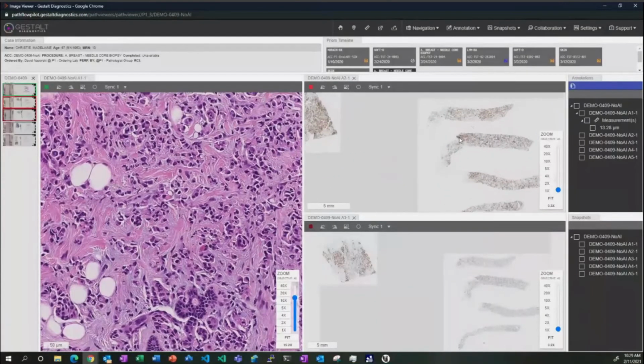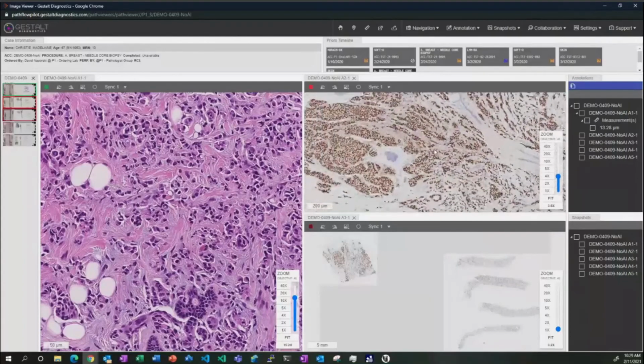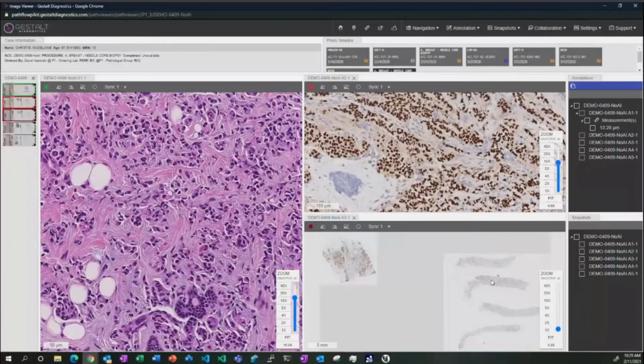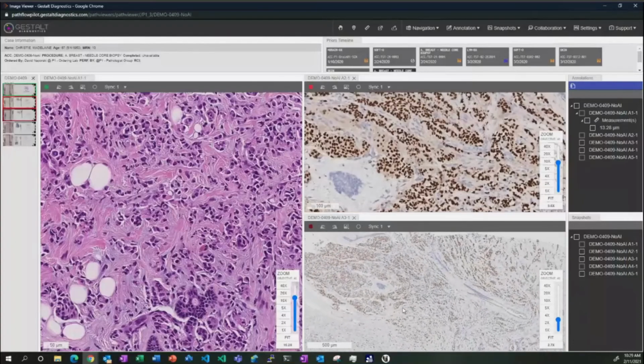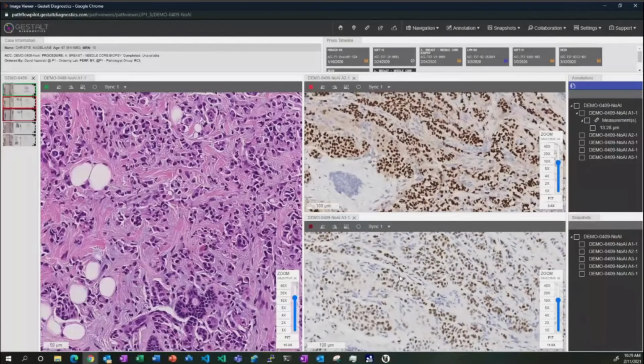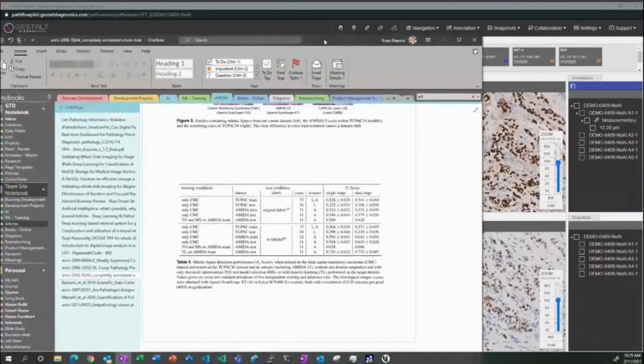So I think that probably at a certain point, like a multitask pipeline would be very helpful in this area, in your domain, in the sense that you can train, for example, a classification and an object detection at the same time, because you can, for example, classify the regions of interest and then train at the same time those same regions with the object detections.